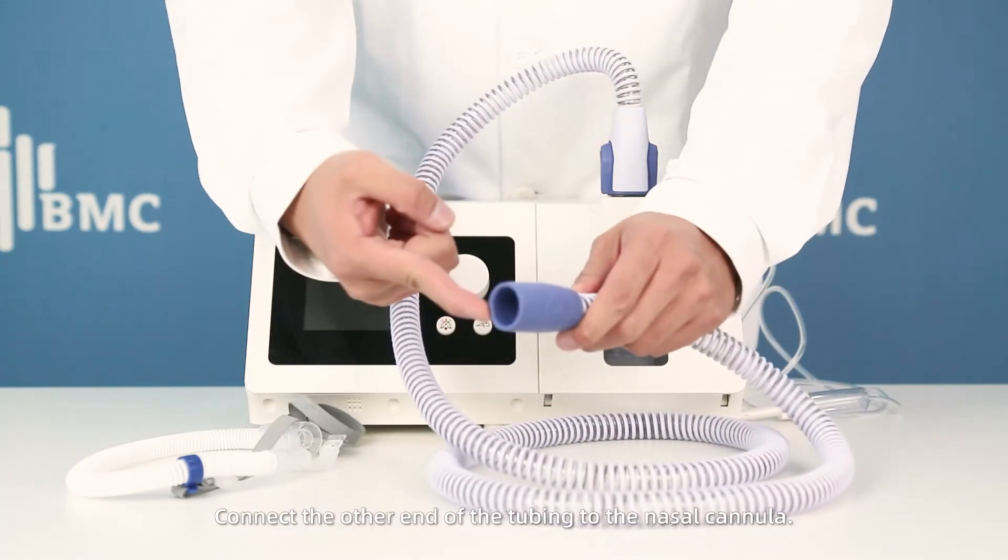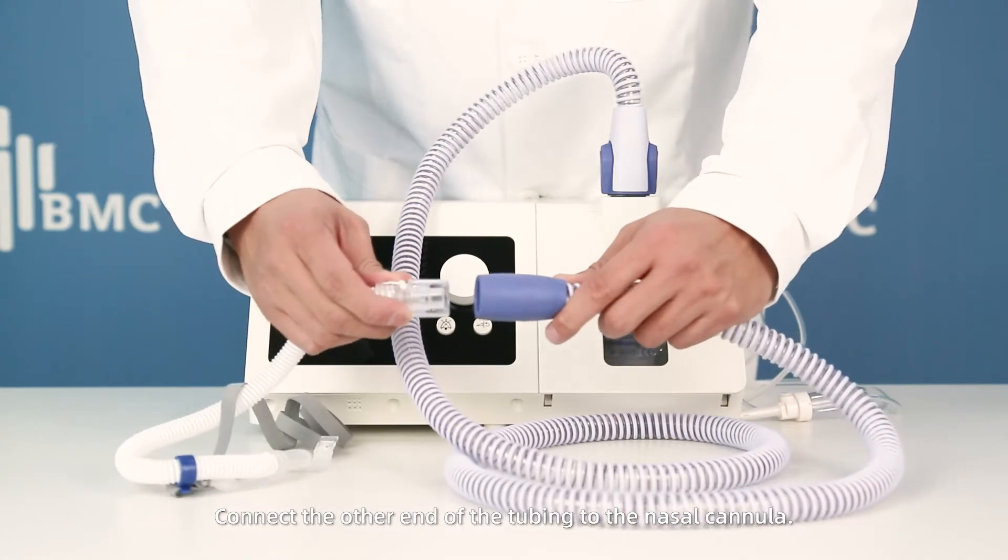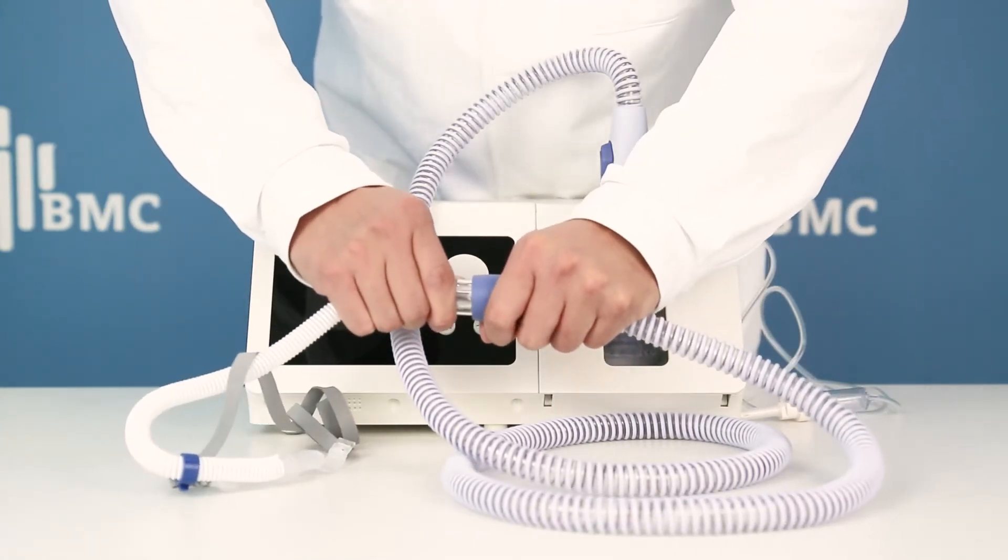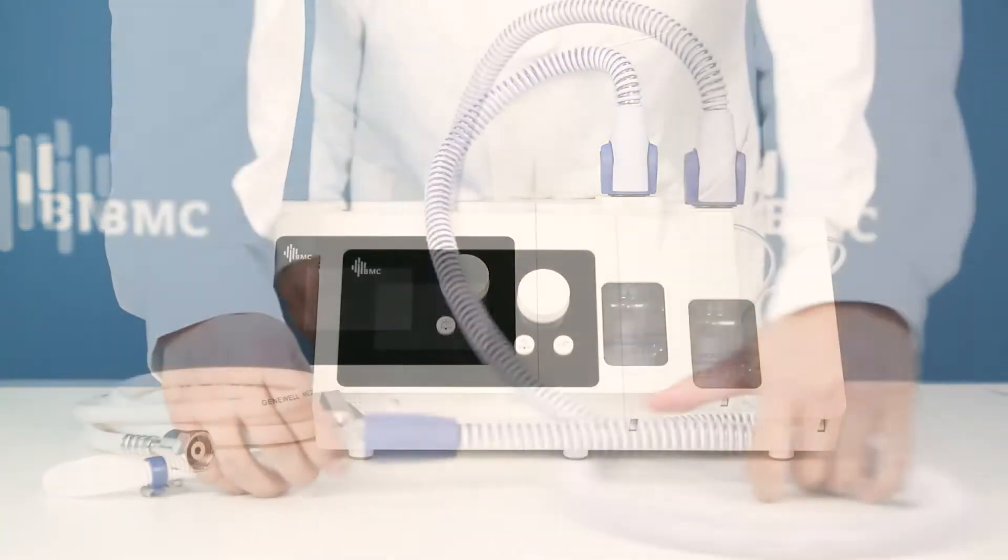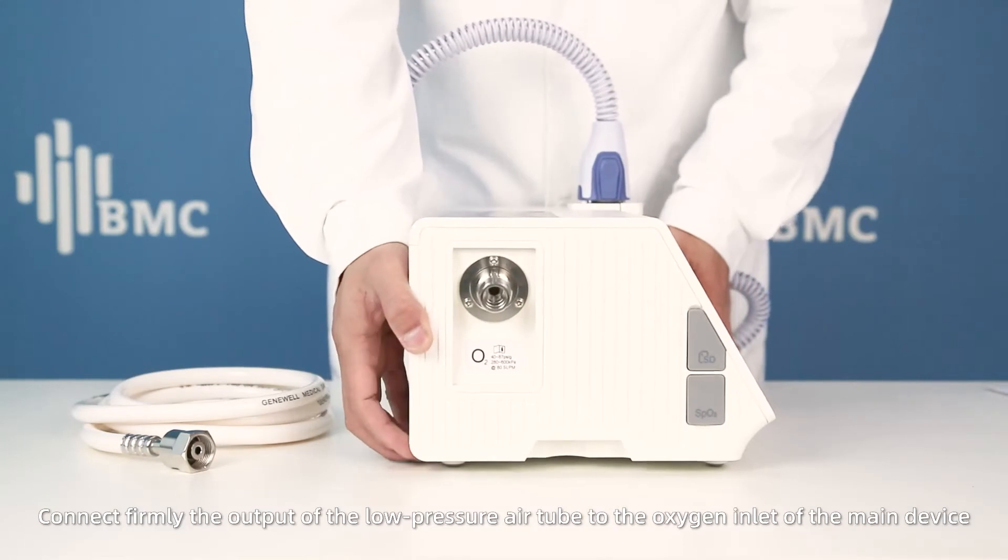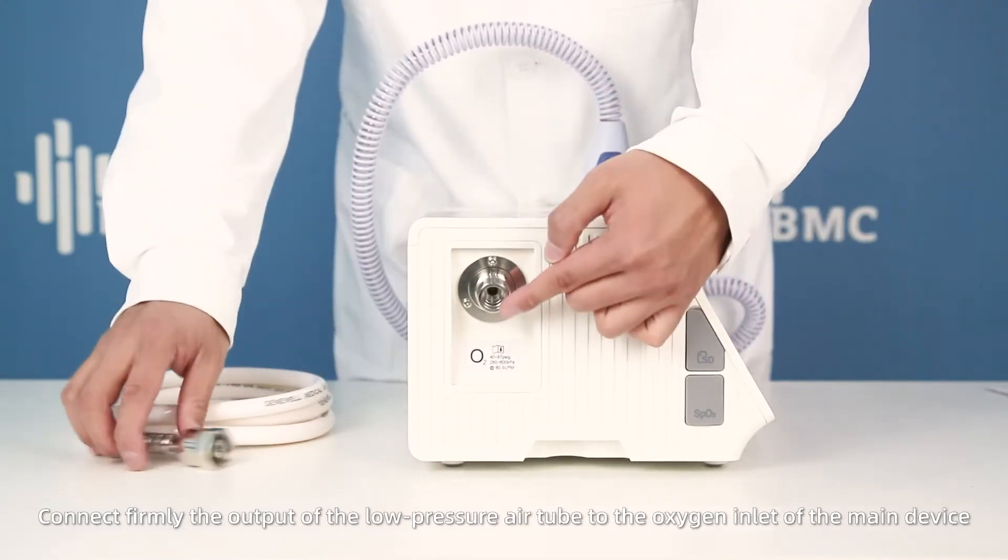Connect the other end of the tube to the nasal cannula. Connect firmly the output of the low-pressure air tube to the oxygen inlet of the main device.